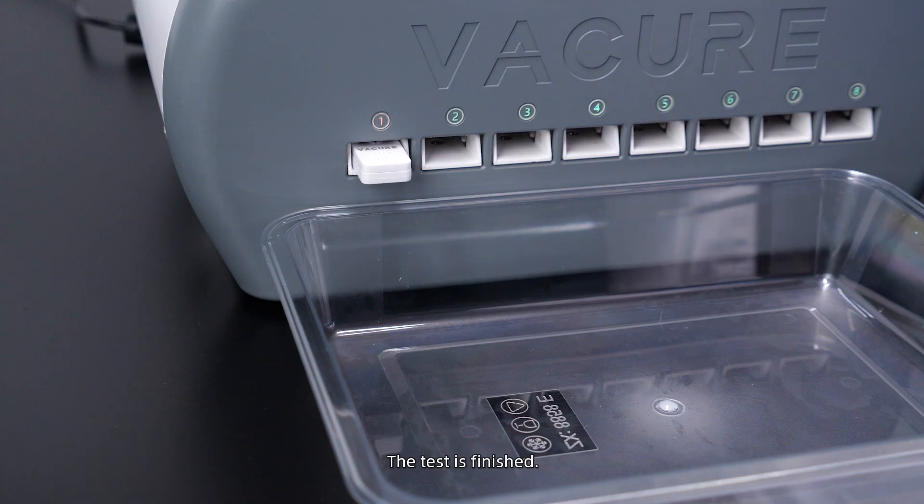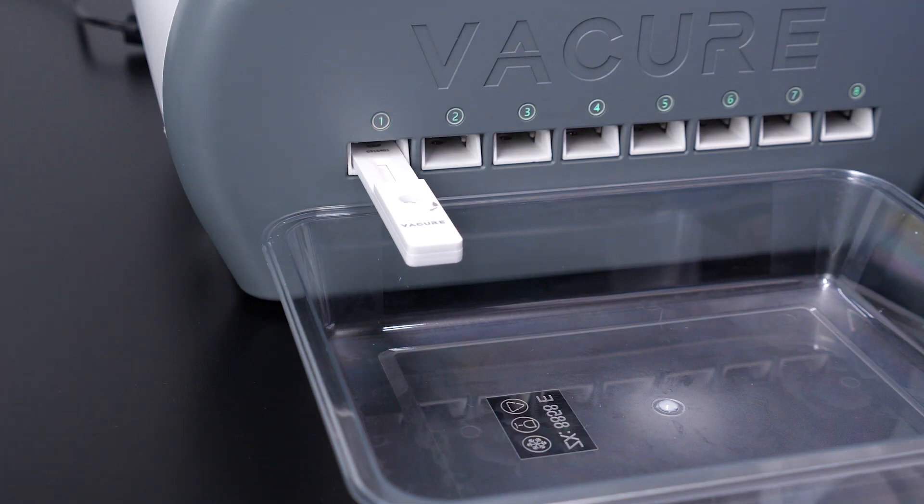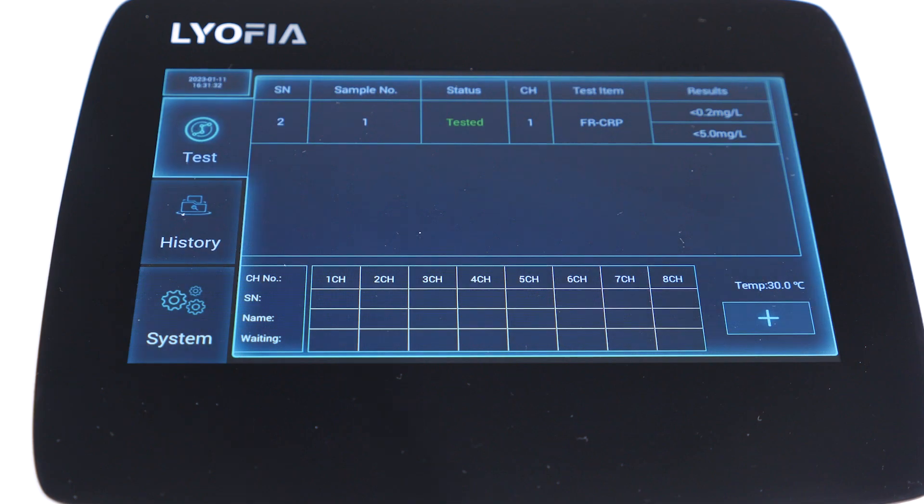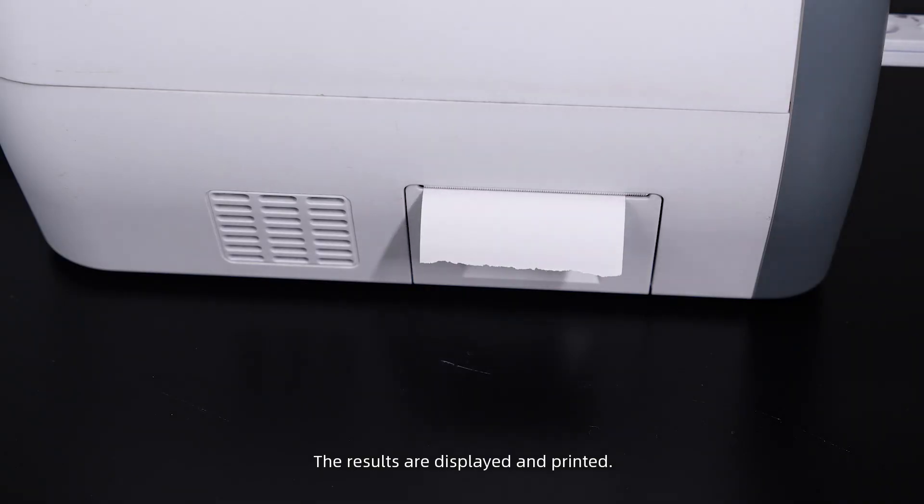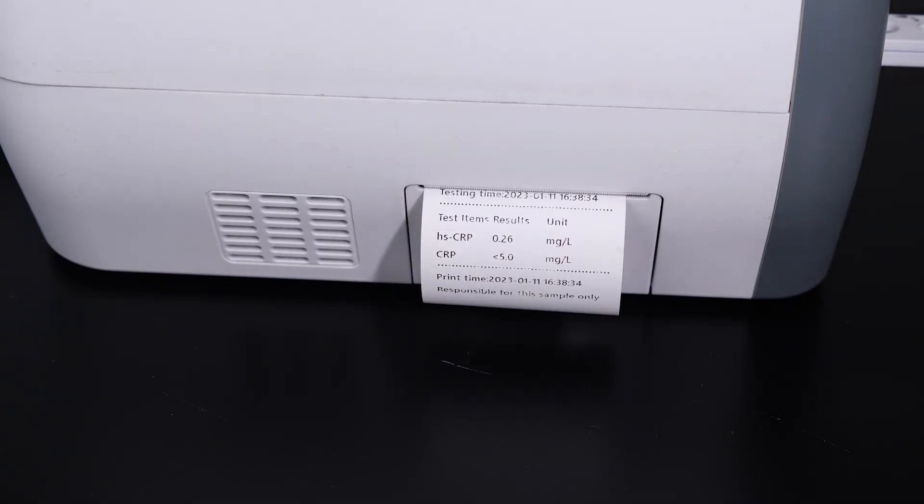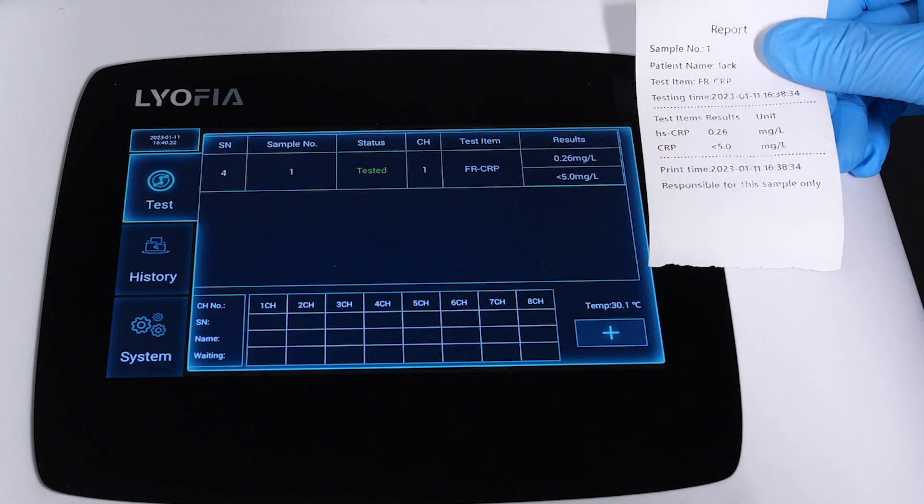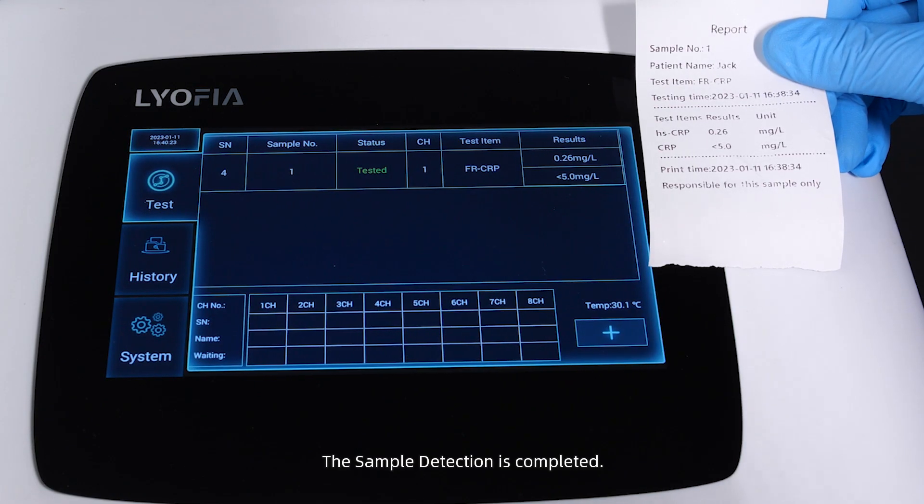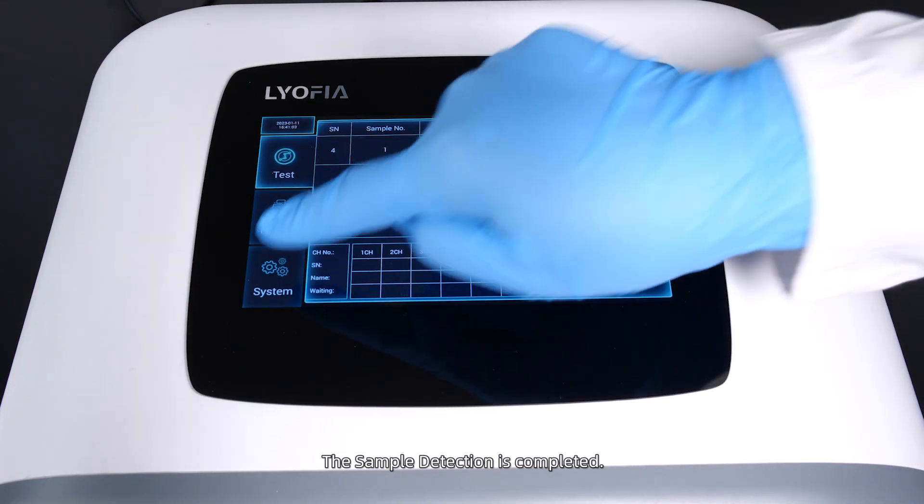The test is finished. The results are displayed and printed. The sample detection is completed.